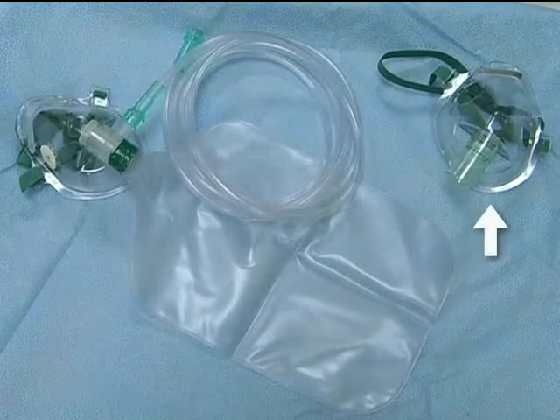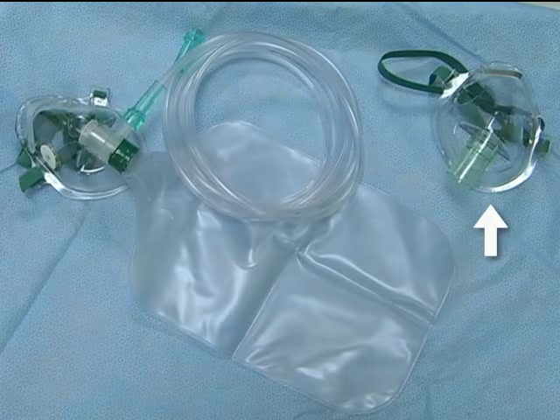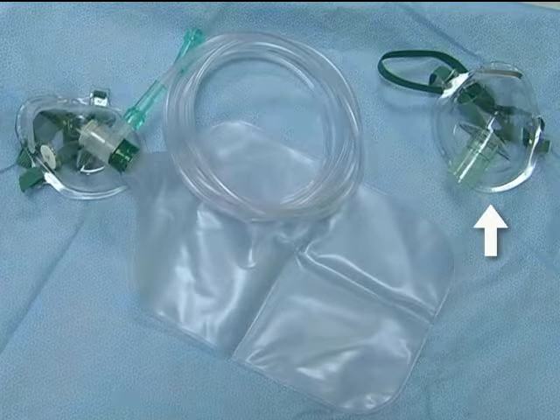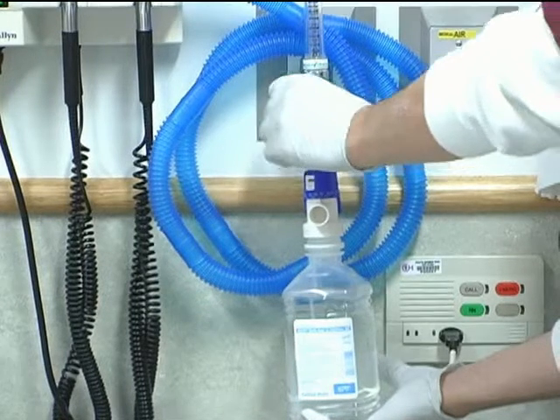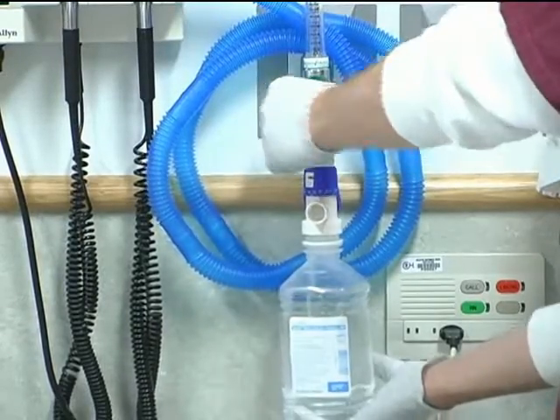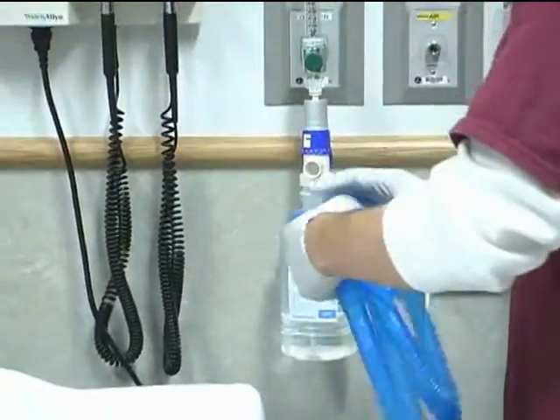Simple face masks can deliver higher and more reliable concentrations of oxygen than a nasal cannula or blow-by oxygen. Oxygen delivered by simple face mask should be connected to a continuous humidification source to prevent drying of the nares and secretions. You are seeing a humidification connection specific to our institution's face mask. Please be familiar with setups that may be different in your area of practice.